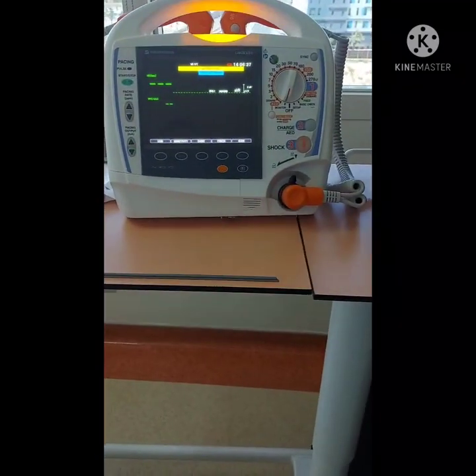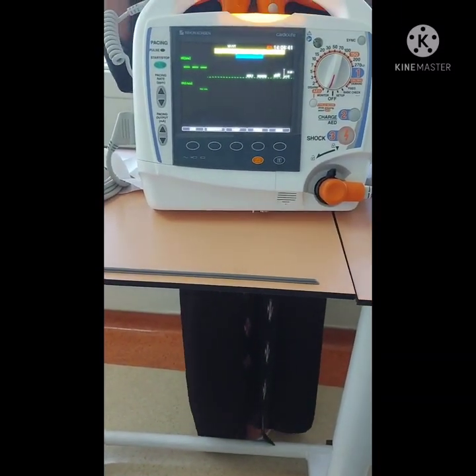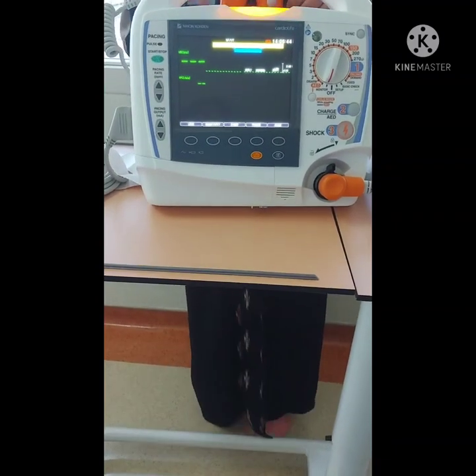Okay. And if you do anything to the patient or you give a shock, it's going to start printing until you finish the shock for the patient. Then it's going to turn it back off.